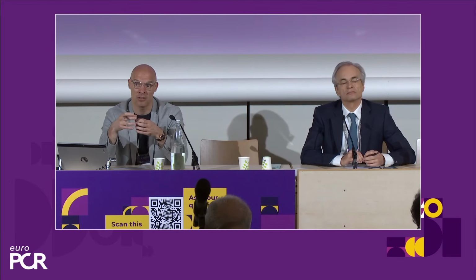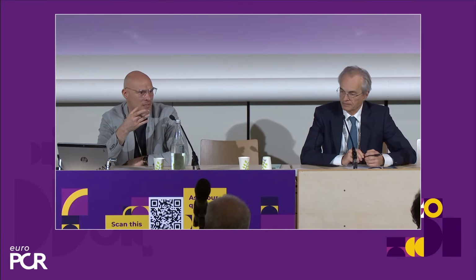What we're doing now with, for instance, a SAPIEN, is that we would add volume to the balloon or take volume out of the balloon, but that will come with consequences, because if you take volume out of the balloon, the expansion of the valve frame will be suboptimal. It will not be expanding to its fullest, and that is associated with, for instance, HALT. So these are intriguing hypotheses, but I think more and more we are getting sensitive to this analysis. Christian, am I overthinking, or is there something here?